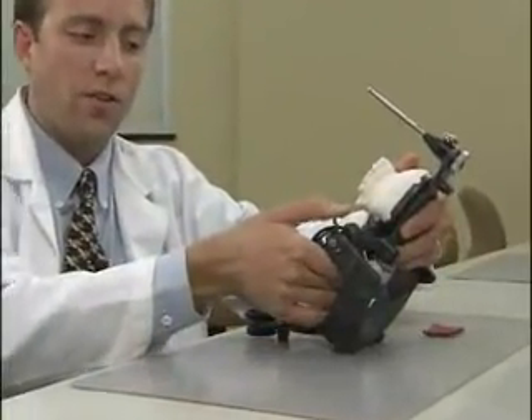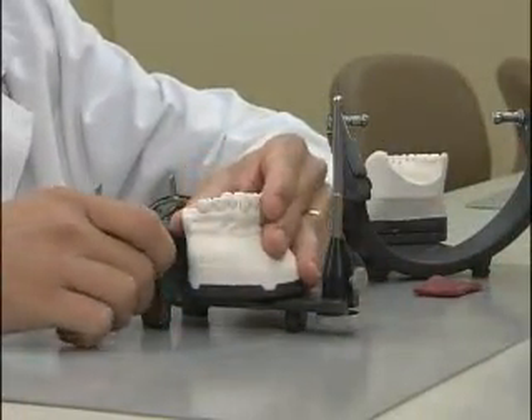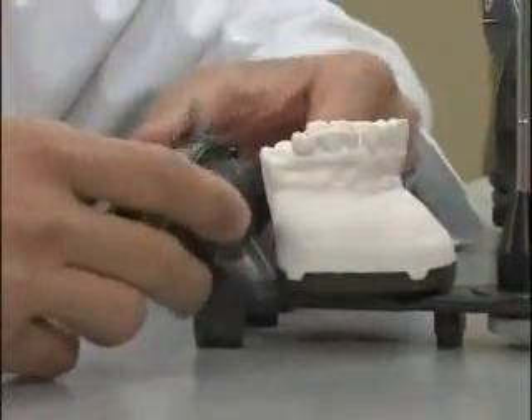Having verified the first point of contact, the condylar inclination should now be set to mimic both functional and parafunctional movements. Start by opening your articulator and undoing the centric latches. Remove the upper member of the articulator and place it on the table. Next, release the hinge boxes by pressing anteriorly on the buttons, and make sure the hinge boxes rotate freely.